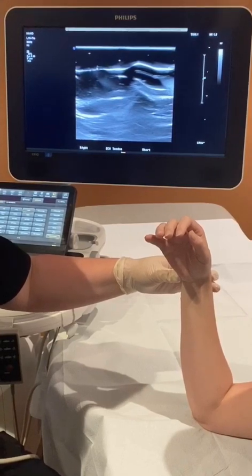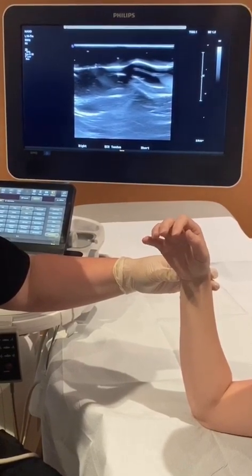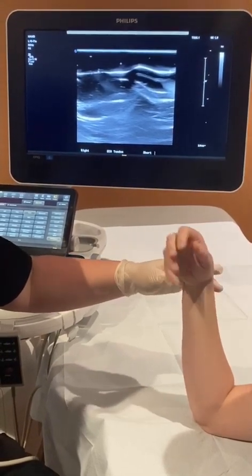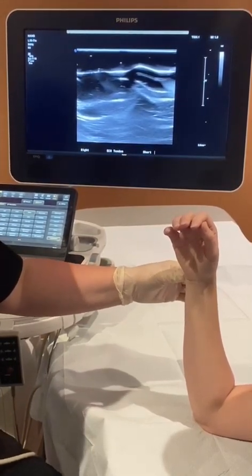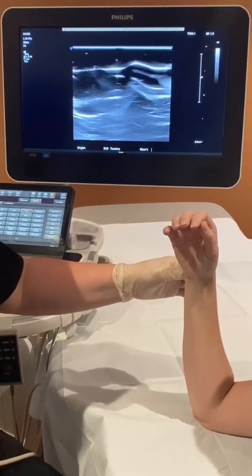This patient presents with ulnar-sided wrist pain and a painful pop during supination of her hand. As she did supination, I could feel a pop right here on the ulnar side of her wrist. So I'm going to do an evaluation of the extensor carpi ulnaris tendon, or the ECU tendon.